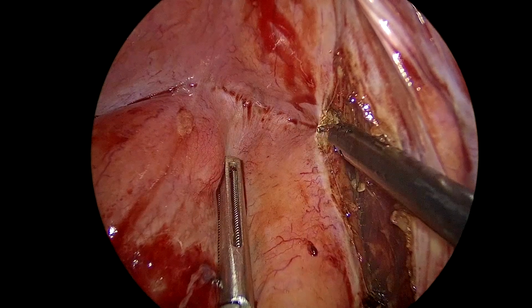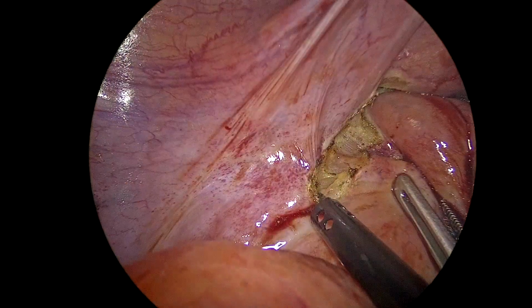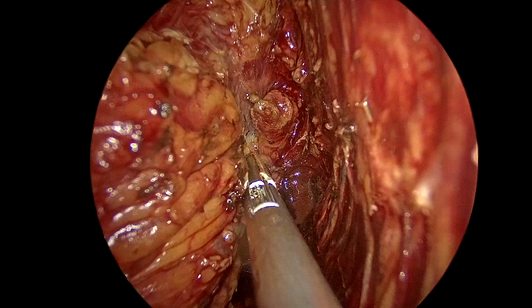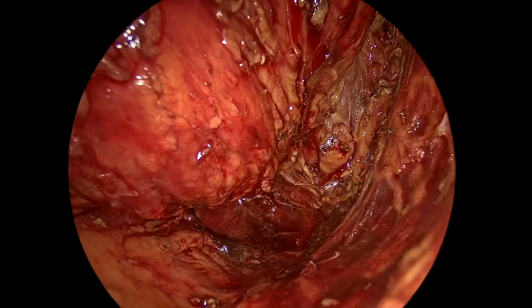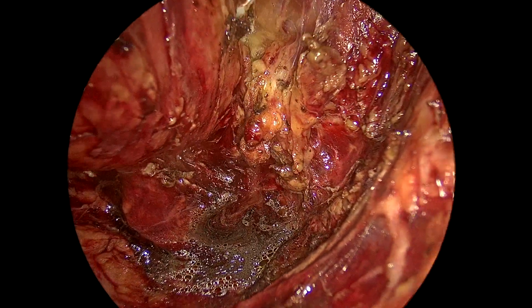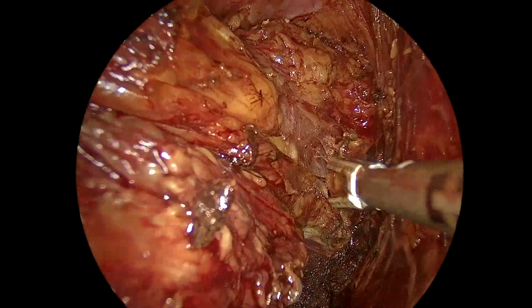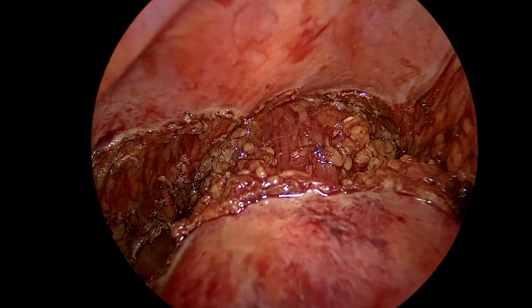Anterior dissection plane is by dissecting along Denonvilliers' fascia, and preserving the seminal vesicle and prostate gland. Complete total mesorectal excision was performed.